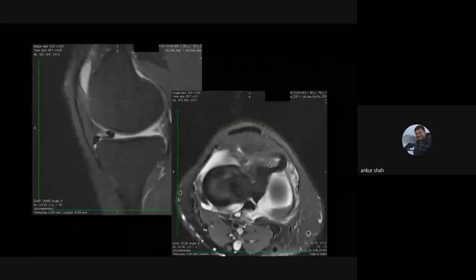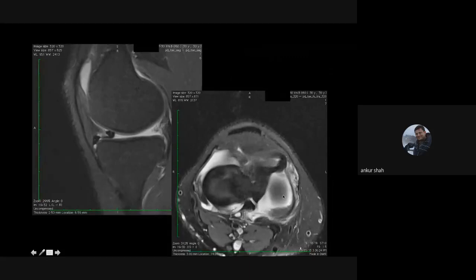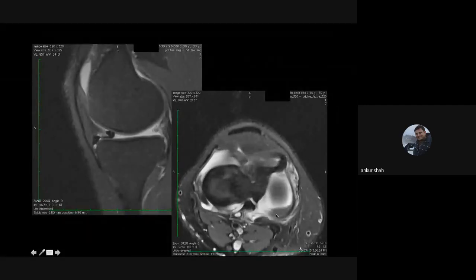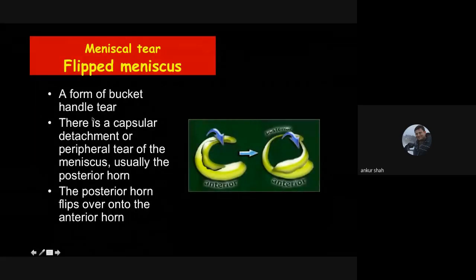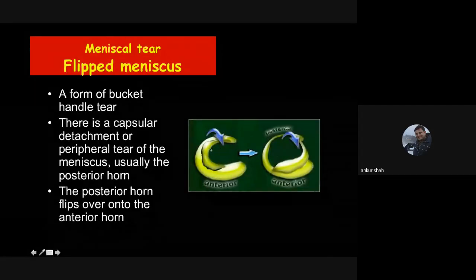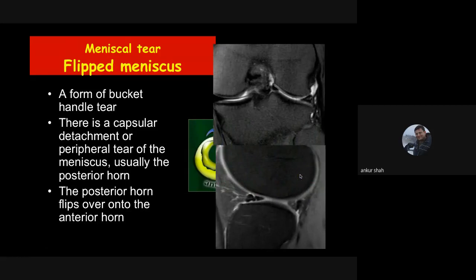In the flipped meniscus tear, along with the longitudinal tear and flipping of the meniscus into the intercondylar region, there is additional capsular injury and the posterior horn of meniscus flips anteriorly. Almost all meniscal tissue is seen at the anterior aspect. This is a form of bucket handle tear where additionally there is capsular injury and all the meniscal tissue is either flipped anteriorly or posteriorly.